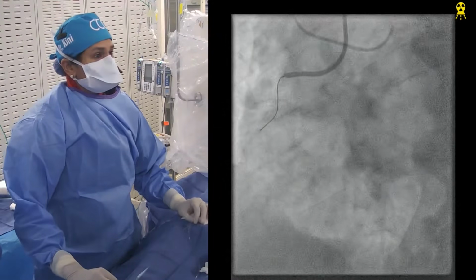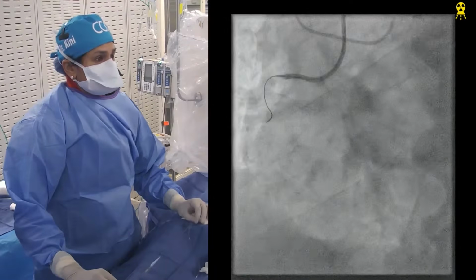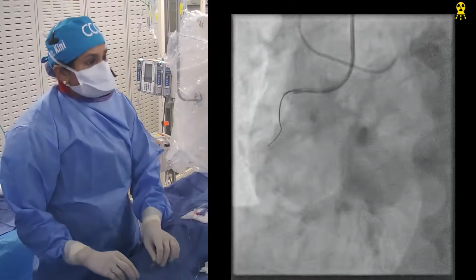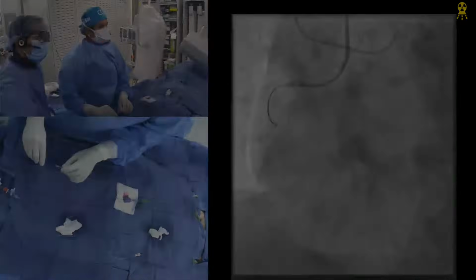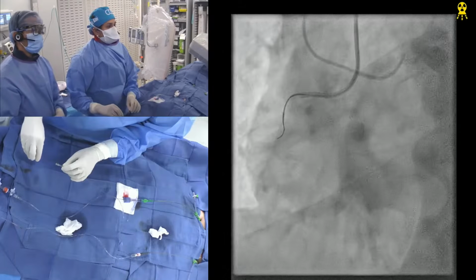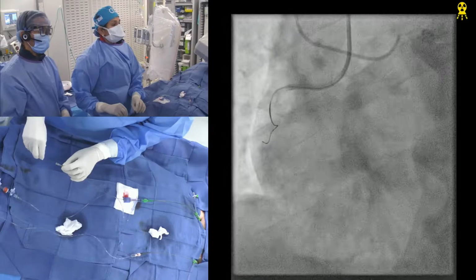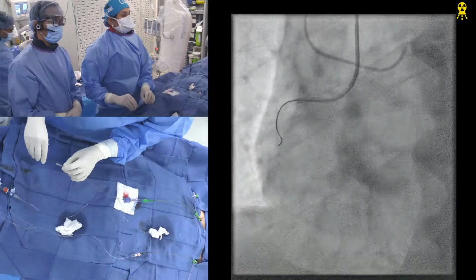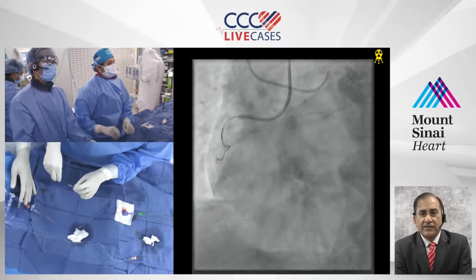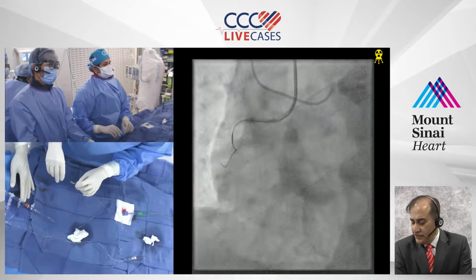And there is not much calcium at the level. There may be a mild or mild to moderate, but it's there. But more is the proximal right here. So we have Corsair and then Fielder. Also look at the tortuosity of the vessel proximal. Look, Anu, before the case when you mentioned the bridge collaterals, I think that is going to be your largest challenge here.